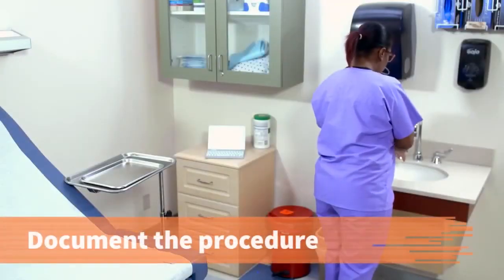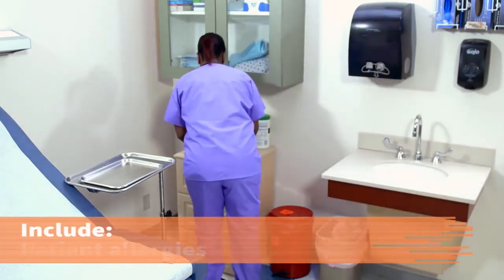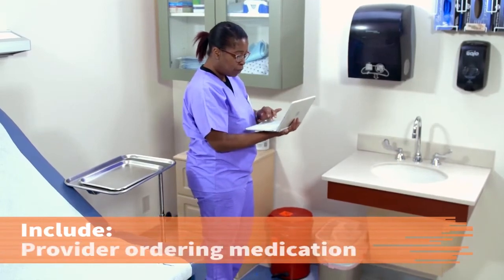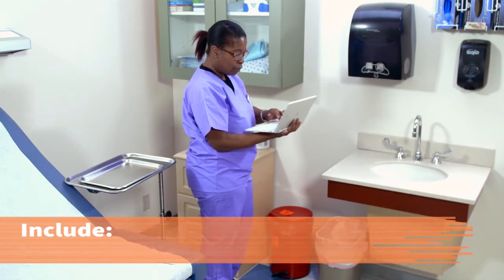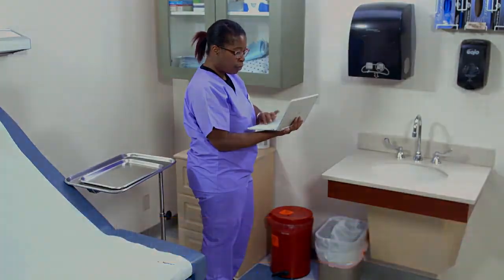Sanitize your hands. Document the procedure in the health record. Include assessments done, patient allergies, teaching or instructions provided, the provider ordering the medication name, dose, route, and how the patient tolerated the medication. Also include the manufacturer, lot, and expiration date of the vial.